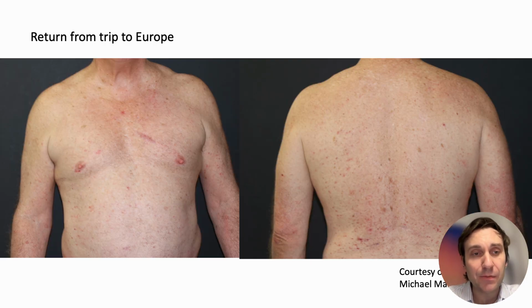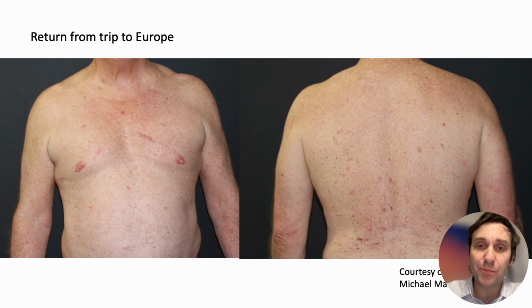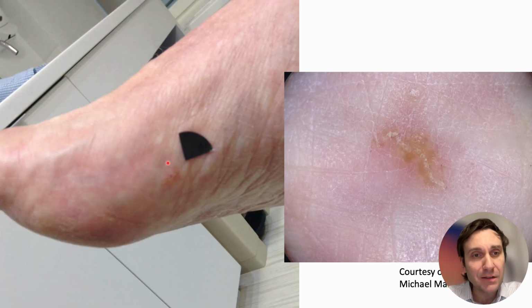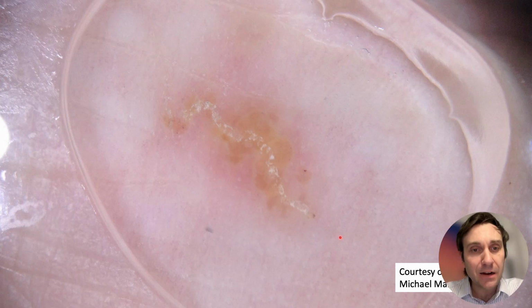Another patient, again, coming from a vacation in Europe, with this widespread rash, very pruritic, and the patient came to us. And we found this lesion here on the sole, right? And you can see here with this magnification, this linear structure, which is the burrow, right? And here you see the delta sign, very small, as I was telling you.